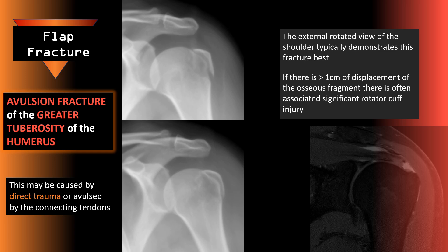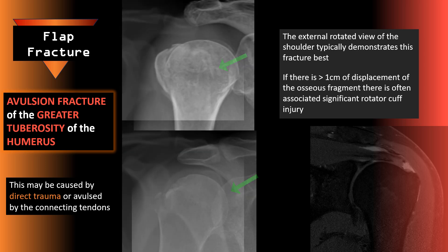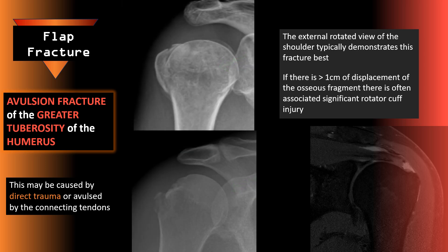A common fracture of the shoulder is a flap fracture — an avulsion fracture of the greater tuberosity of the humerus. The external rotated view of the shoulder typically demonstrates this fracture best. If there is over one centimeter of displacement of the osseous fragment, there is often associated significant rotator cuff injury, so MRI of the shoulder is often recommended.